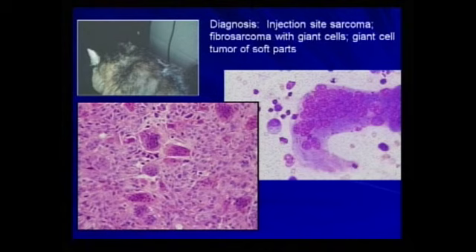So just to come back to what I think is an extremely important point for doing cytology, or a couple of them. Number one, use the history. And then the second thing is you're not going to get to a definitive diagnosis on the majority of cases. That is not the ultimate in doing cytology. But to be able to give a clinician a good differential diagnosis is a good day's work done.